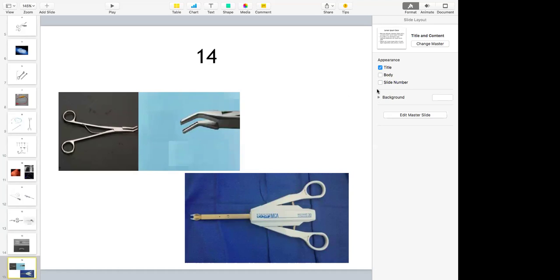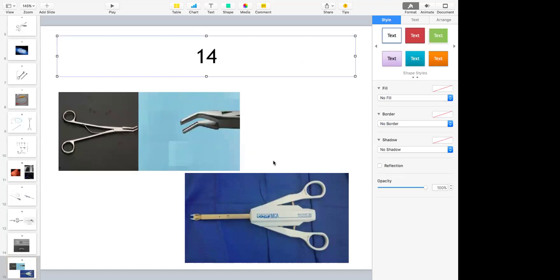No. Actually, even in open cholecystectomy, you can put open clips on the cystic duct before cutting it instead of tying the cystic duct. But apart from any such occlusion, either hemostasis or occluding some luminal structure, these clips are also used after you have done breast conservation surgery in breast cancer, you apply clips at the margins of the cavity, the tumor bed.